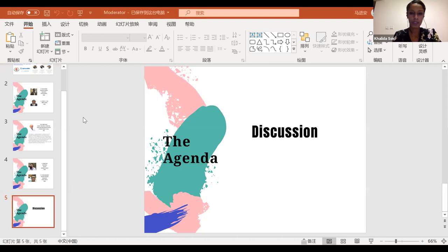Professor Ronco? Well, first of all, except at the very early beginning when we started CRRT in these patients and we saw the hypercoagulable state, we did not have any clotting of cartridges during treatment. We have to, first of all, monitor the coagulation state of the patient. Some of these patients already receive heparin systemically. In the extracorporeal circuit, we tend to use normally 5 to 8 units per kilogram per hour. And in general, in these patients, we had to scale up the administration to 15, in some cases to 20.